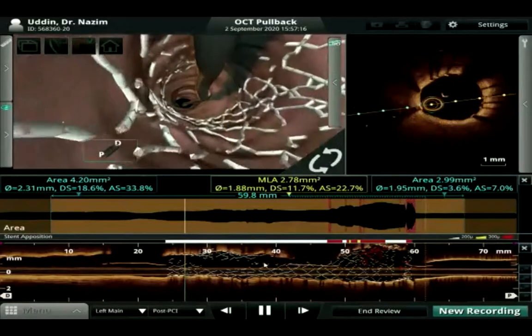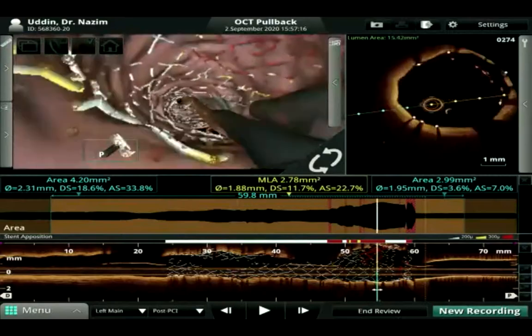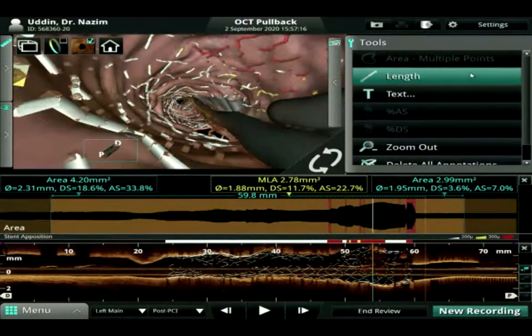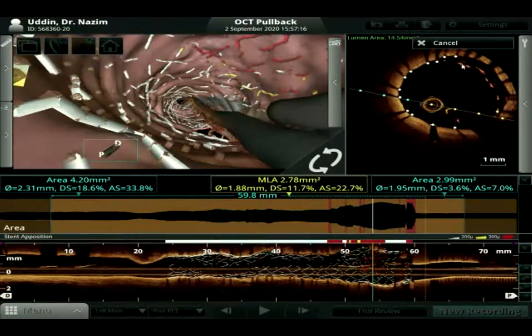Good. Any more comments about the OCT, Dr. Akasaka? Yes, it might be okay. I hope many doctors can understand the fly-through image. Also, the color bar in the middle of the longitudinal view is the lumen profile. It's an automatically detected lumen diameter, right? So we went to 4.5 here. Do you think we need to go with 5 millimeter?